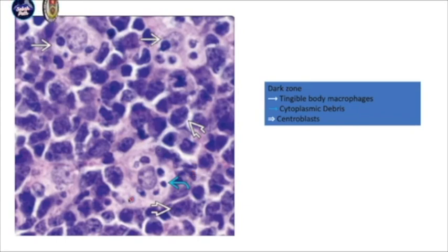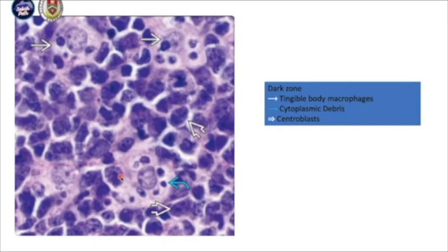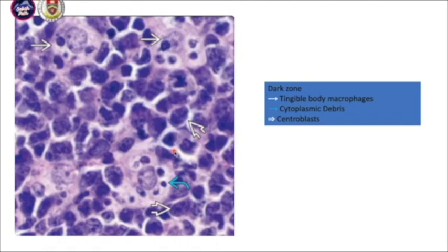Within the benign lymphoid follicle, you also have tingible body macrophages. So if the lymphoid follicle has a prominent, well-defined germinal center with a well-defined mantle zone rimming the area, and within the germinal center you can see tingible body macrophages with light and darker areas — these are the characteristics of benign or reactive lymph nodes.